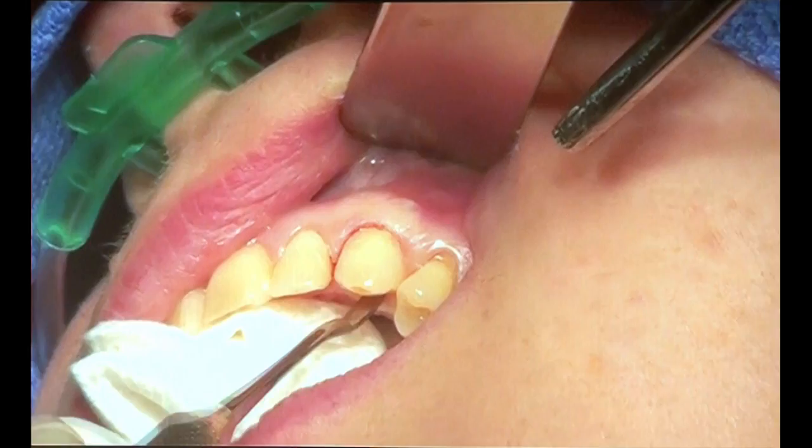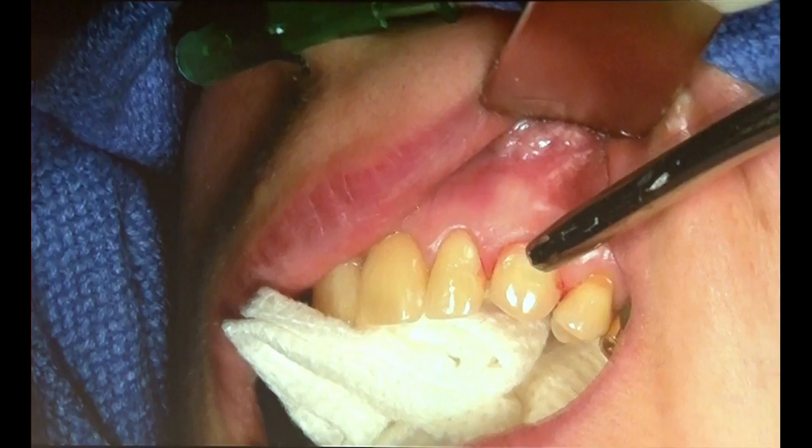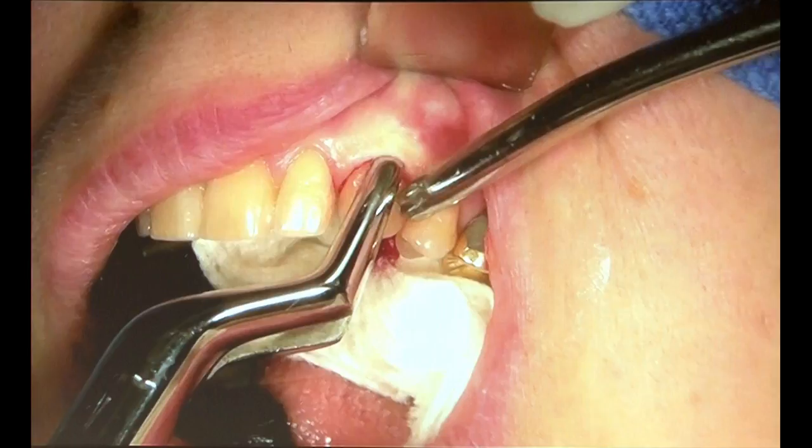And so with the removal of the canine, the goal is to minimize trauma to the site, minimize soft tissue reflection so that we are able to maintain the connective tissue that is present around this tooth. And so you can see the gentle removal of the canine.